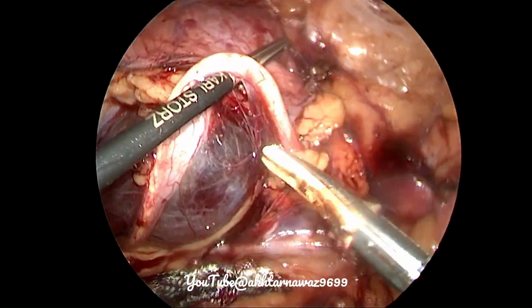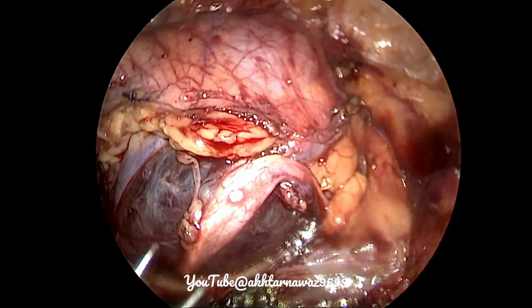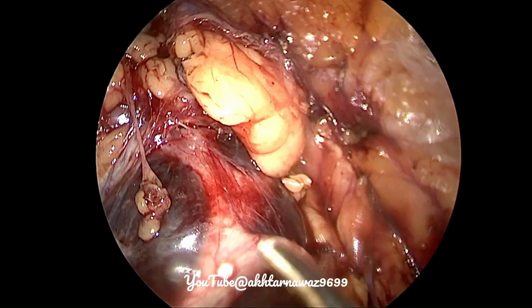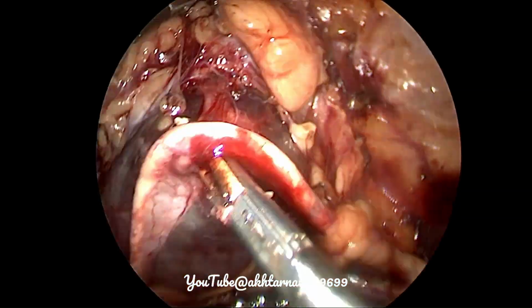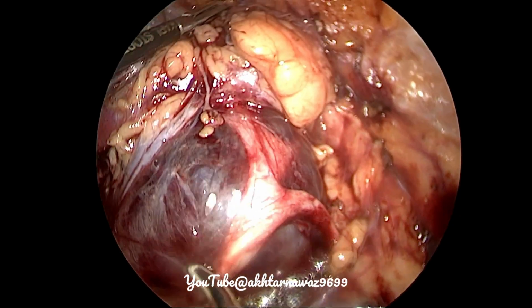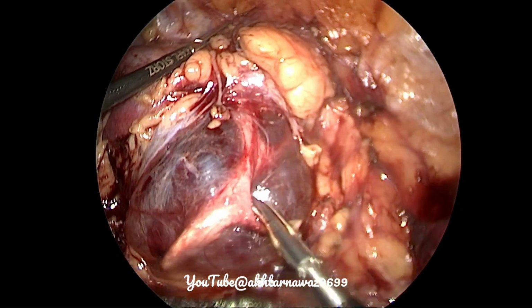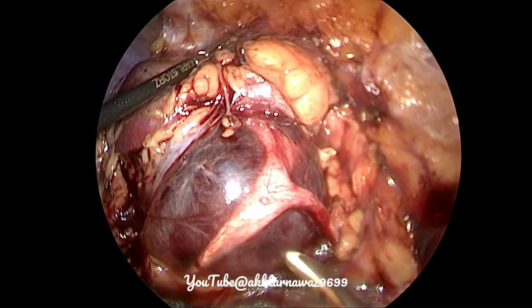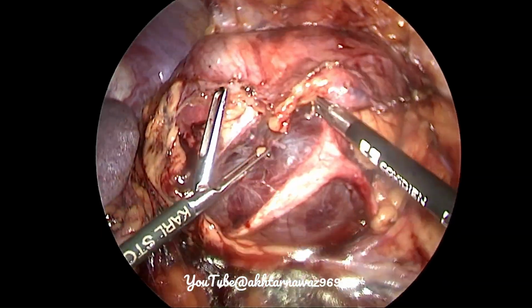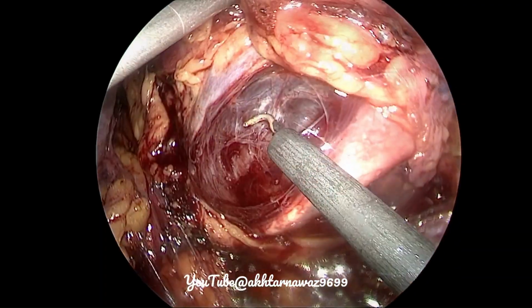So this is the ureter having a DJS stent in it, which is leading to the pelvis, the upper calyx, the middle and the lower calyces. So our main aim is to dissect the pelvic calyceal system away from the cyst, so that we can make a puncture below or above the pelvic calyceal system and drain all the fluid and make a sufficient excision of the wall, so that no more fluid collects there.